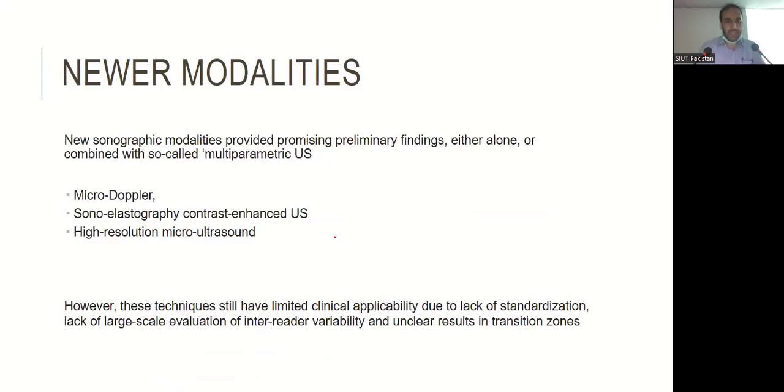The newer sonographic modalities provide promising preliminary findings, either alone or combined in so-called multiparametric ultrasound: microDoppler, sonoelastography, contrast enhanced ultrasound, and high resolution micro ultrasound. However, these techniques still have limited clinical applicability due to lack of standardization, lack of large-scale evaluation of inter-reader variability, and unclear results in the transition zone.